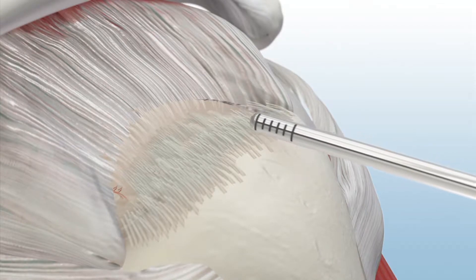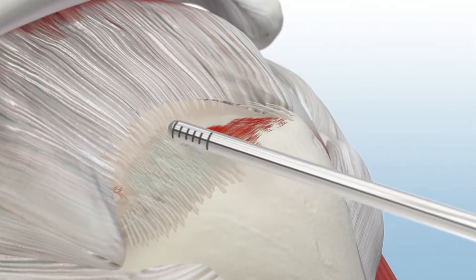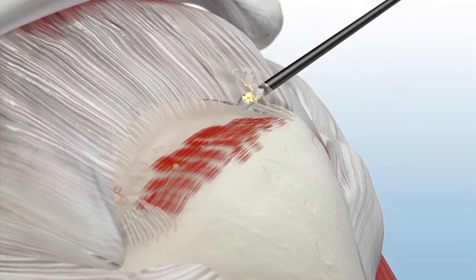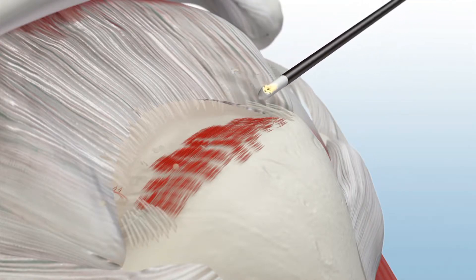To begin, prepare the footprint in subacromial space using a ConMed dual-purpose shaver blade and the Edge bipolar arthroscopic RF device.